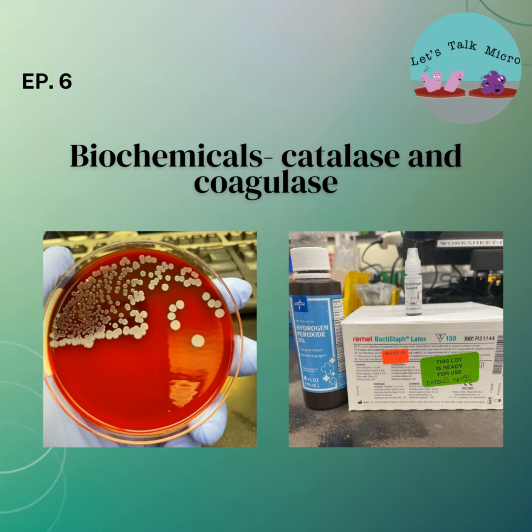Today we discussed two very important biochemicals. When you start at the top, catalase: if catalase is positive, you move to coagulase. Then, depending on the result, you have Staphylococcus aureus or CNS, coagulase negative Staphylococcus.